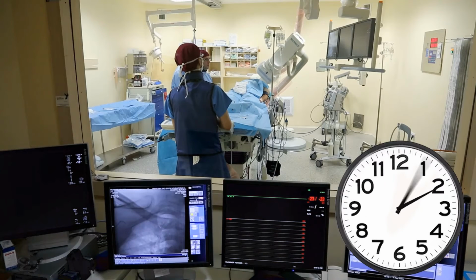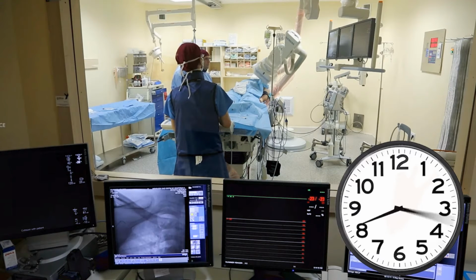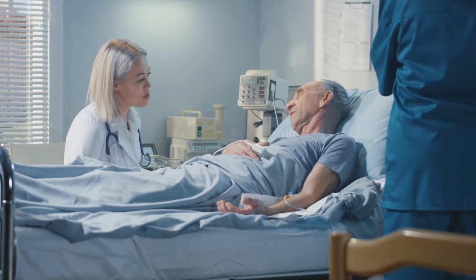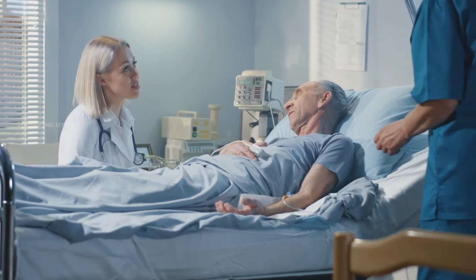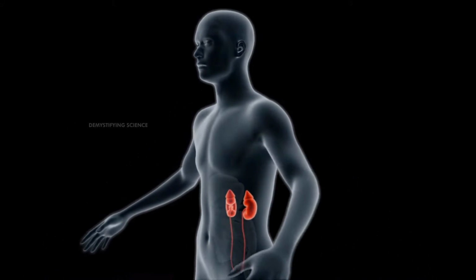You can expect the test to last half an hour, although it can sometimes take longer. After the angiography, you may need to stay in the hospital for several hours or overnight following the procedure. You may be asked to drink fluids to prevent dehydration and flush the dye from your kidneys.